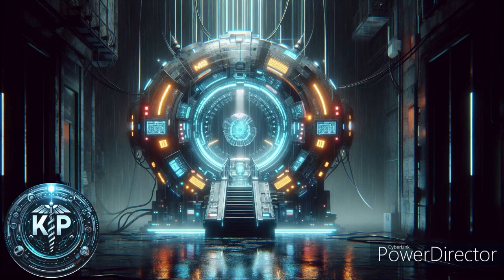Superconducting coils. These are used in the main magnet to create a strong magnetic field. They are cooled to cryogenic temperatures to reduce electrical resistance and allow for the maintenance of a high magnetic field with minimal power consumption.